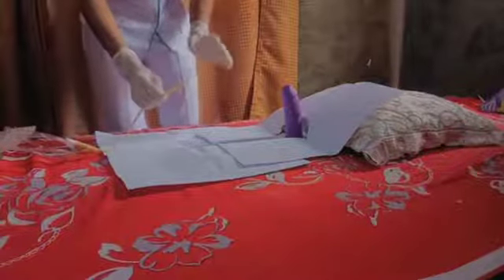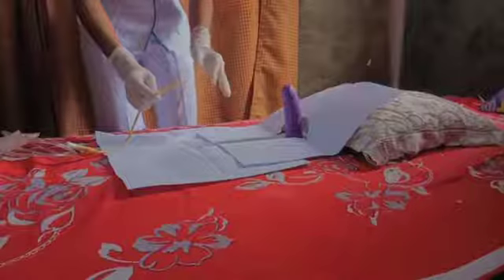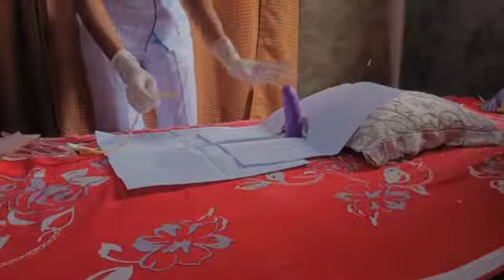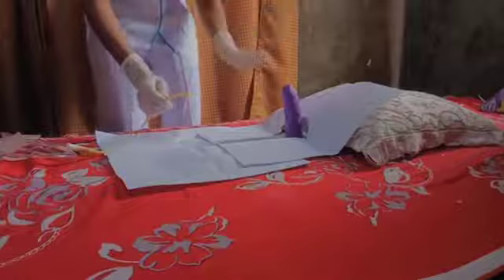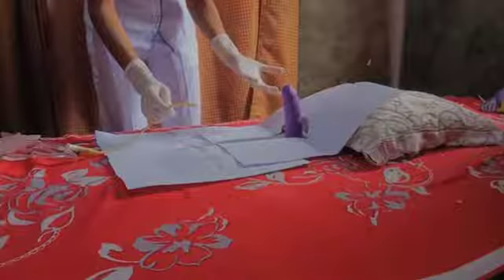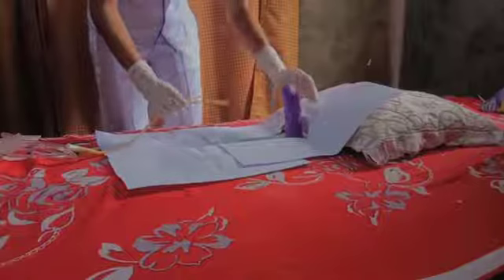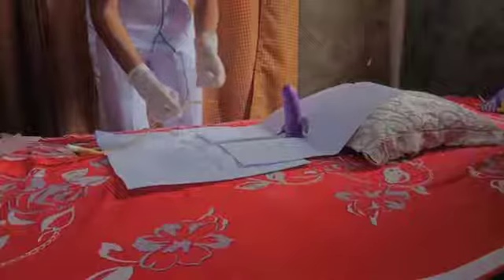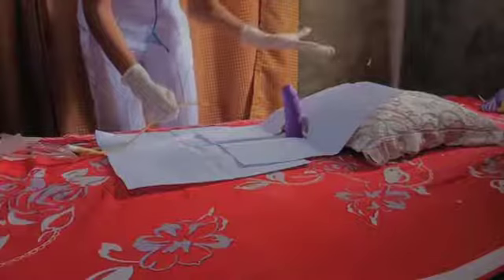Ideally the tip of the catheter should be coated with lubricant — let's say that has already been done. With our non-dominant hand, we place it at the penis in a perpendicular position to expose the urethra and to properly insert the catheter.